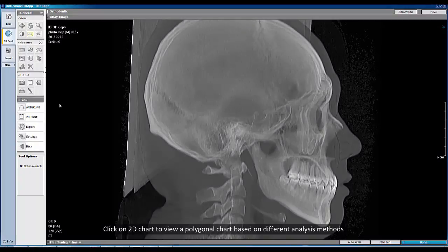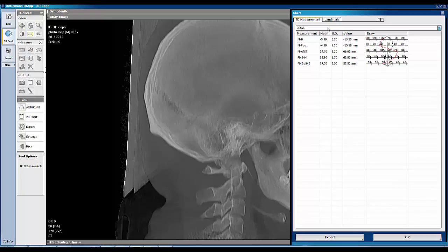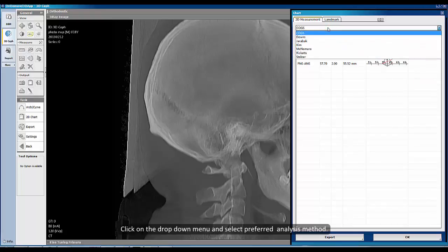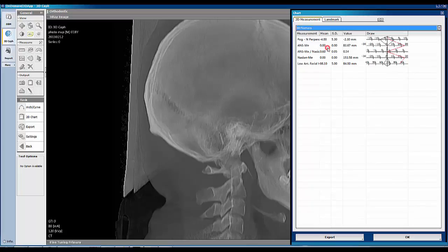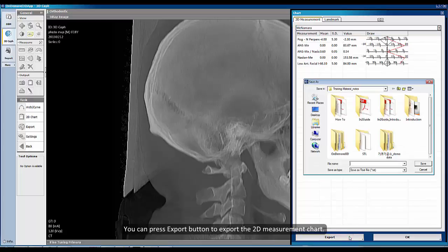Click on 2D chart to view a polygonal chart based on different analysis methods. Click on the drop-down menu and select your preferred analysis method. You can press the export button to export the 2D measurement chart.